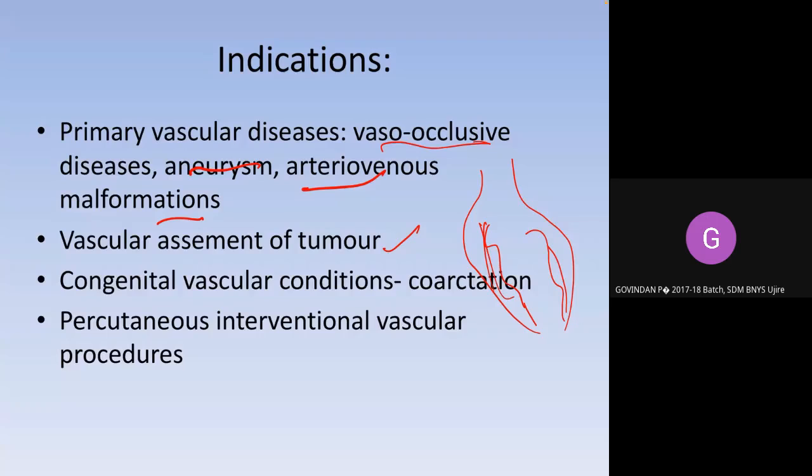What do you mean by vascular assessment of tumor? Checking the tumor markers in the blood. No, not tumor marker. What you see is how is the blood supply of the blood vessels to the tumors. Yeah, that's exactly what you see. How much blood vessels are there? Because any property of a tumor is to have what is it called, formation of blood vessels?